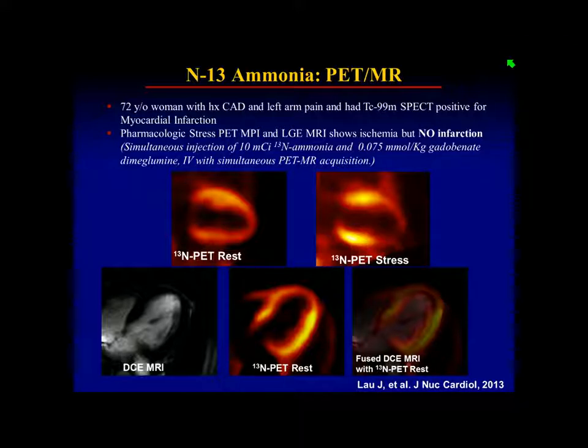So they came in again, and there is reduced perfusion on the stress image. And also what you can see, we're using contrast agent as well. So here's the PET-MR and contrast fused agent. So we're happy, and hopefully someday we'll actually get to use it. We do use it for a lot of other studies, but we just haven't moved our ammonia forward.